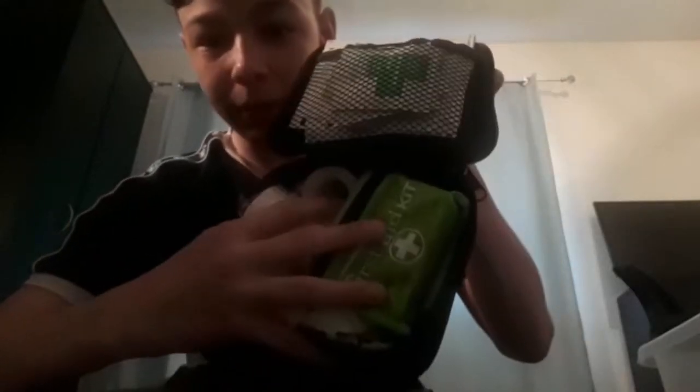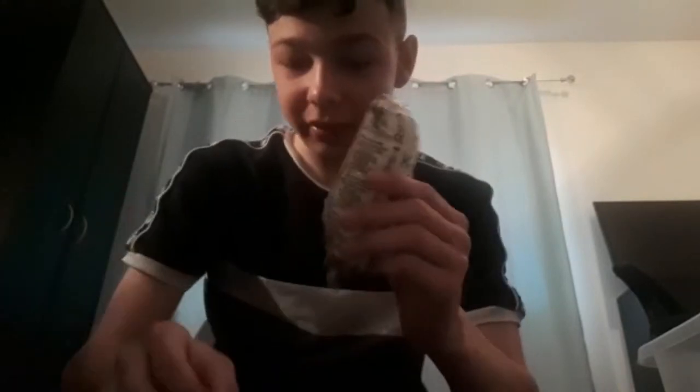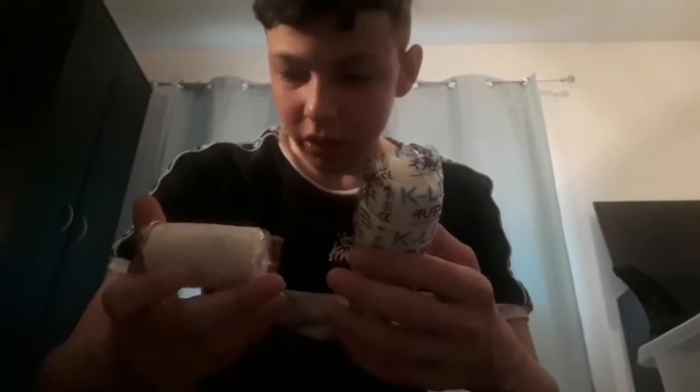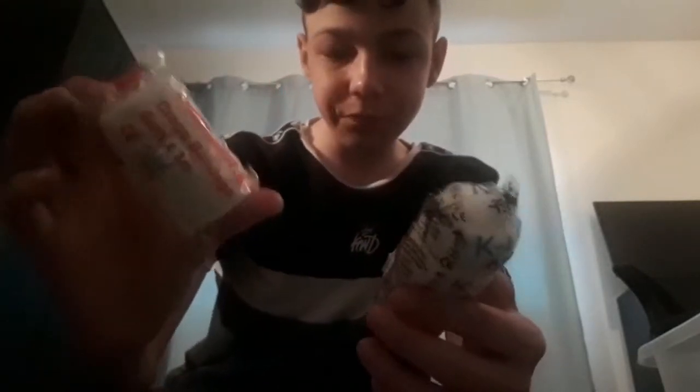If you open the first aid kit, this is how it looks. I have lots and lots of plasters — not going to get them all out. I have antiseptic wipes here and antiseptic wipes there. I don't know why I'm carrying ten antiseptic wipes, but you know. I've got a bandage and also a six-by-three clip bandage.